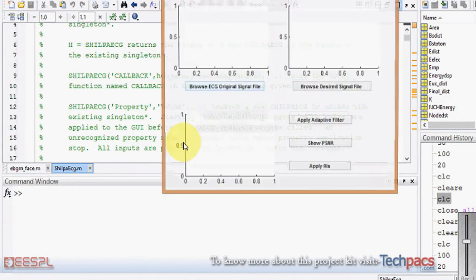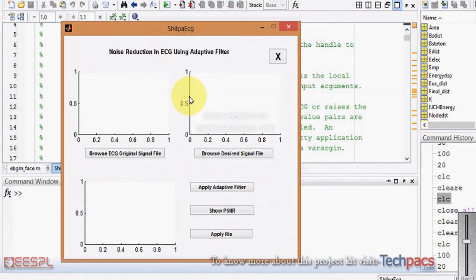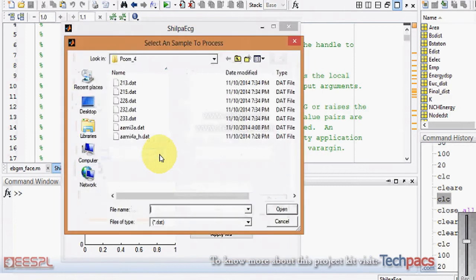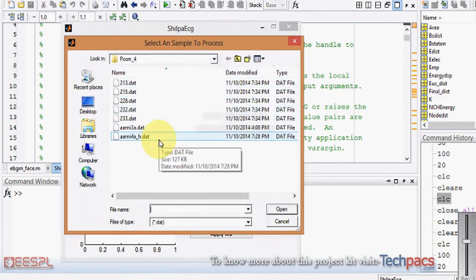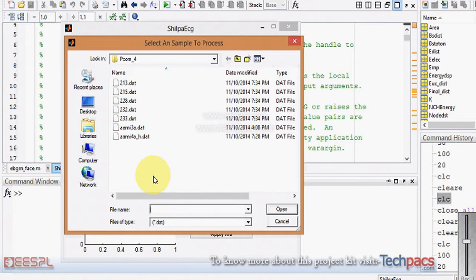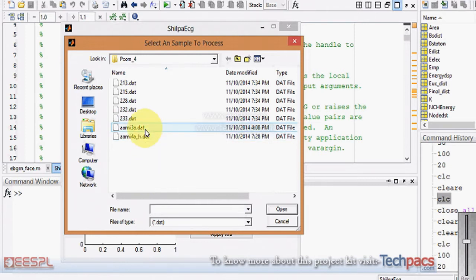Here is an adaptive filtration process to reduce the noise from the ECG signal. When I click on this button, it will give me an option to select the dataset, which we have taken from the internet — that is physionet.org and many other websites where datasets are available for research purposes.